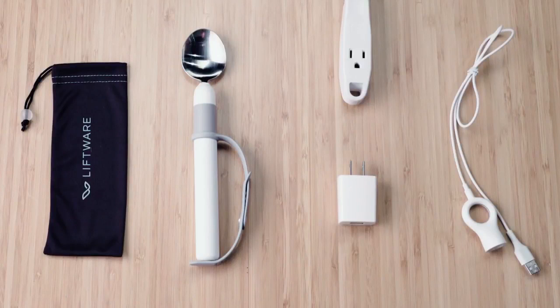The Liftware Level Starter Kit includes the leveling handle with a hand strap, a soup spoon attachment, and a charging cable.